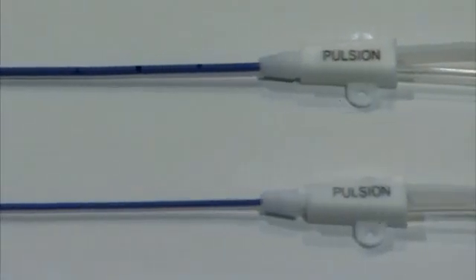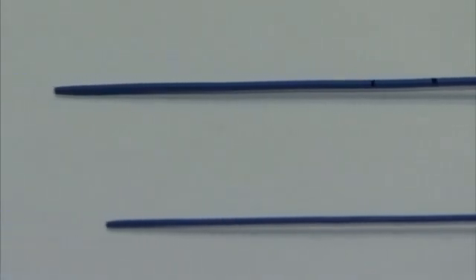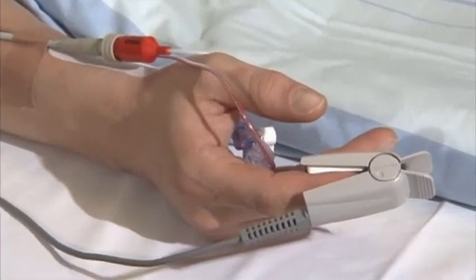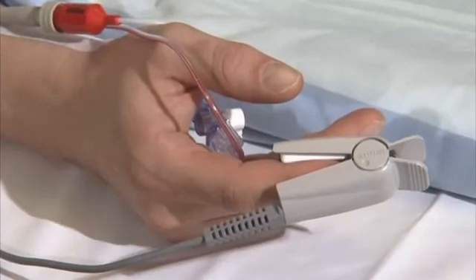In children, thin catheters 7 or 8 centimeters in length are placed in the femoral artery. As with all arterial catheters, it is important that you monitor the peripheral circulation while it is in situ.